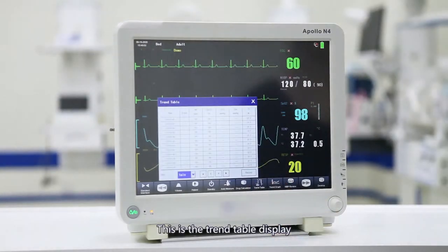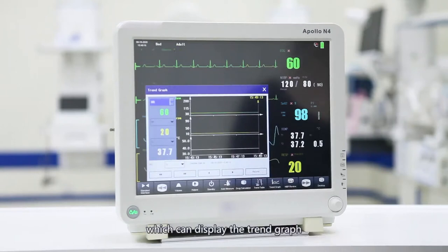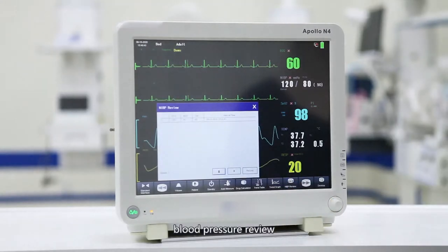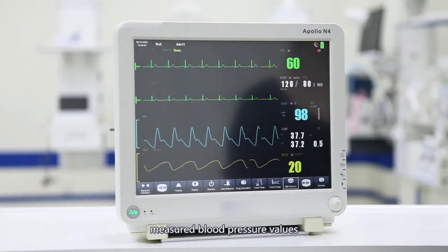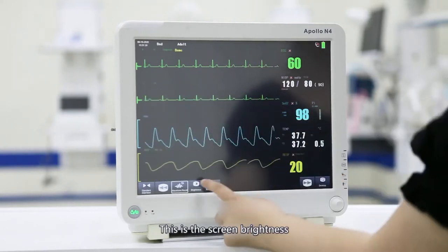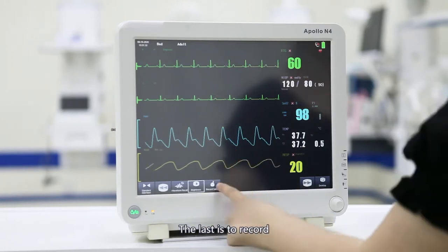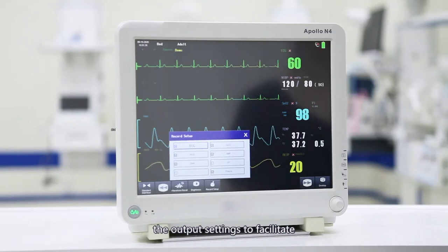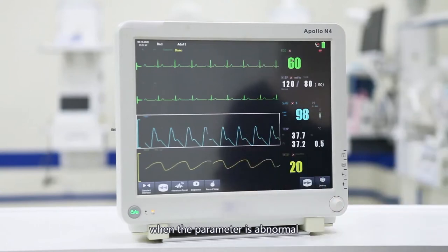This is the trend table display, where you can view the parameter changes corresponding to each parameter. This is the trend graph display, which can display the trend graph changes of parameters. This is the non-invasive blood pressure review, where you can view historically measured blood pressure values. This is the waveform playback. You can adjust the screen brightness. The last is the record output settings, to facilitate doctors and nurses in capturing the moment when a parameter is abnormal.